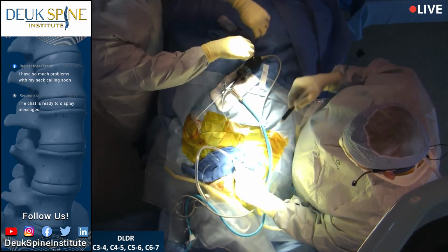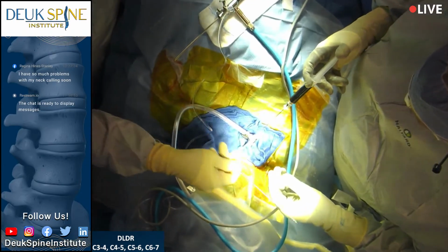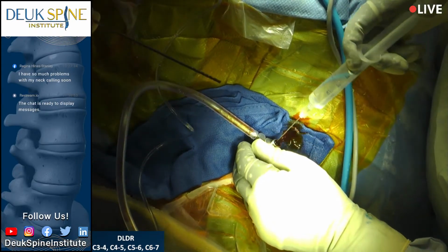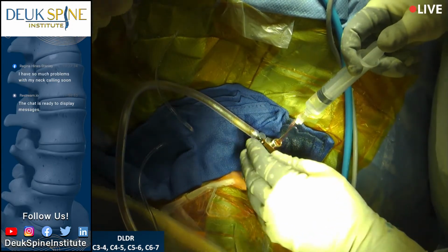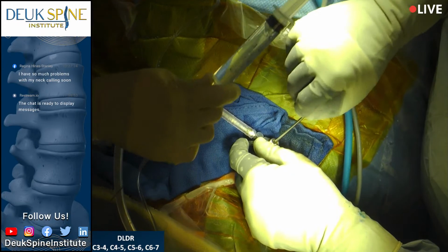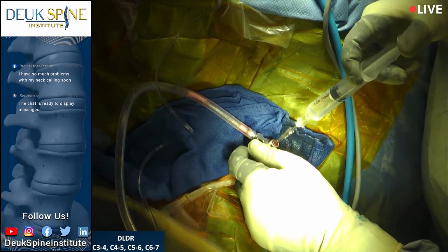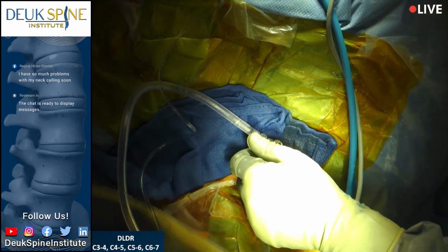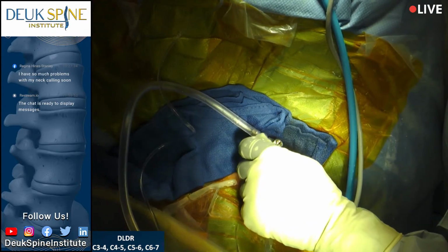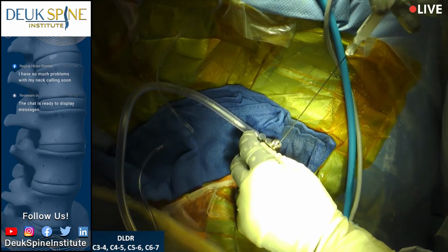I'm going to use a little antiseptic. So this is sticking on my glove, and the antiseptic is nice. We've never had an infection. Don't want one. I'll take another one of those. You have plenty of irrigation, right? Yeah. And I think this has a little stuff in it. Gonna have to pipe clean it out. Now we've never had an infection with a laser surgery. Dilator. I'll take the dilator back in a moment after you clean it out.